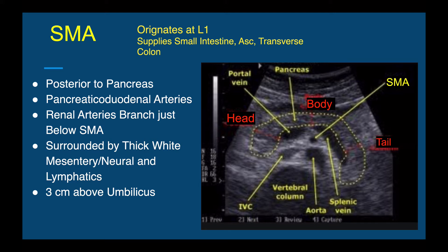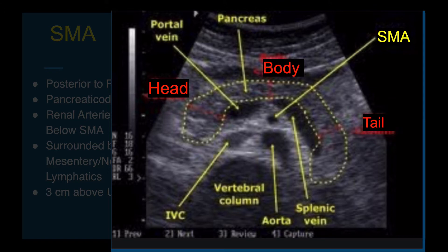The superior mesenteric artery originates at L1 and supplies the small intestine, the ascending, and the transverse colon. The SMA is in the region of the pancreas, running just posterior to it — so if we see the SMA, we know just anterior to that we will see the head and body of the pancreas, and possibly the tail on the left side. It gives branches of the pancreaticoduodenal arteries. The renal arteries branch just below the SMA. The SMA is the most readily identified branch of the aorta because it's surrounded by thick white mesentery, neural and lymphatic structures, and can be found about three centimeters above the umbilicus.